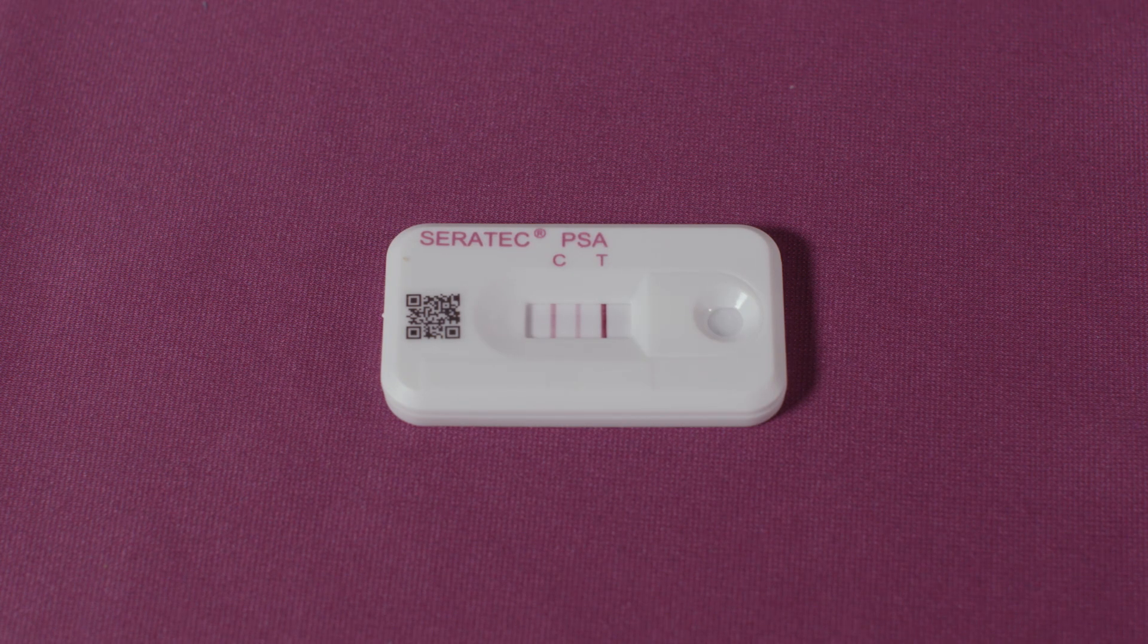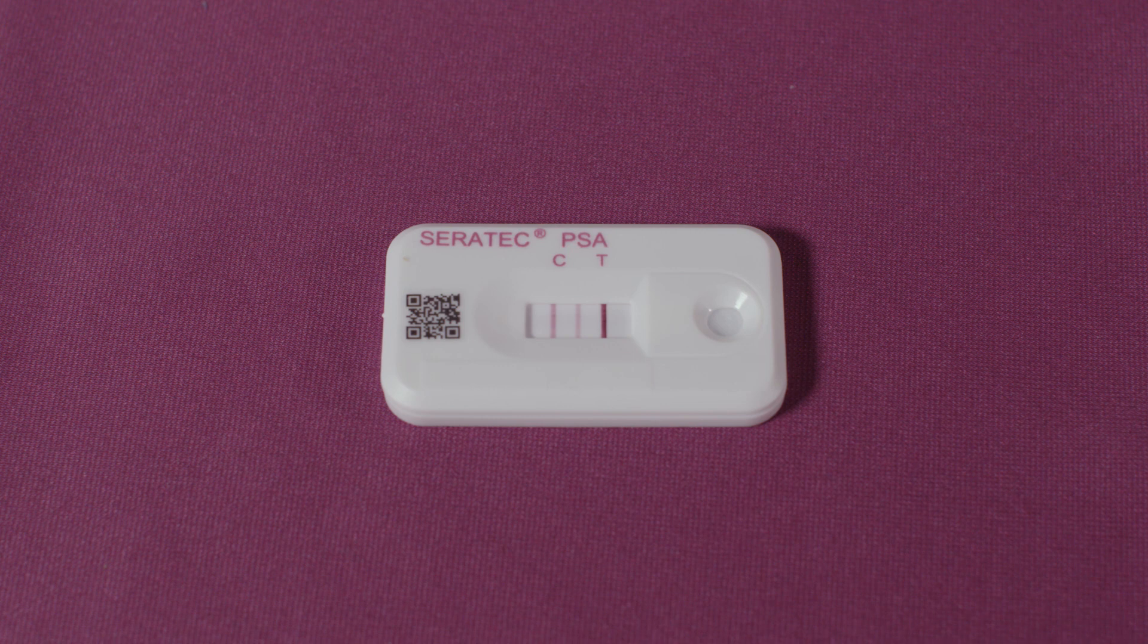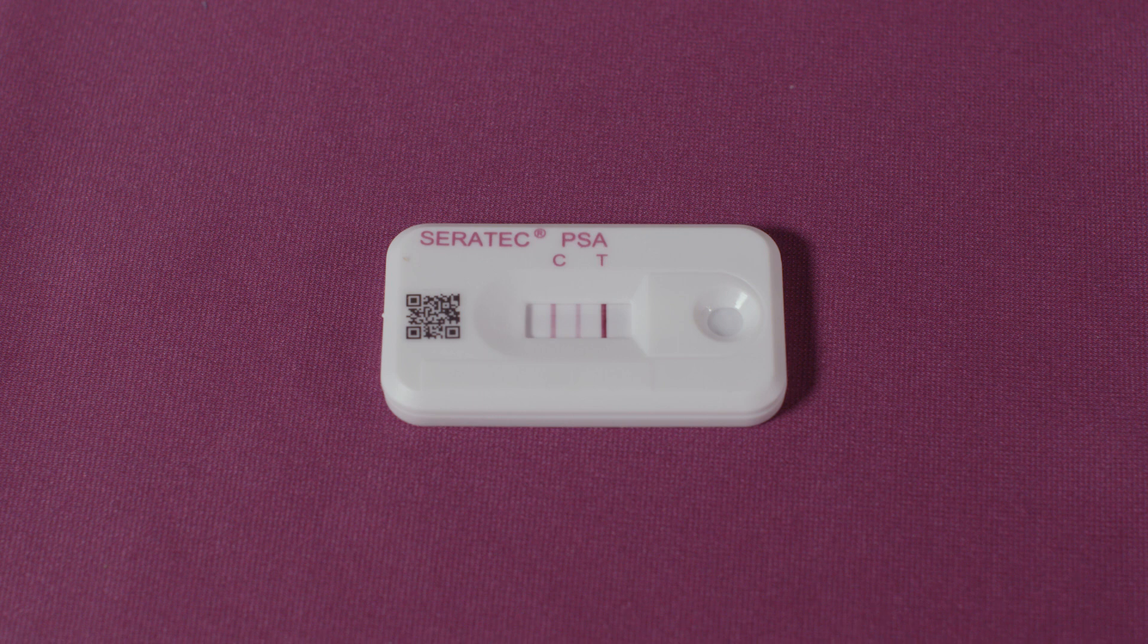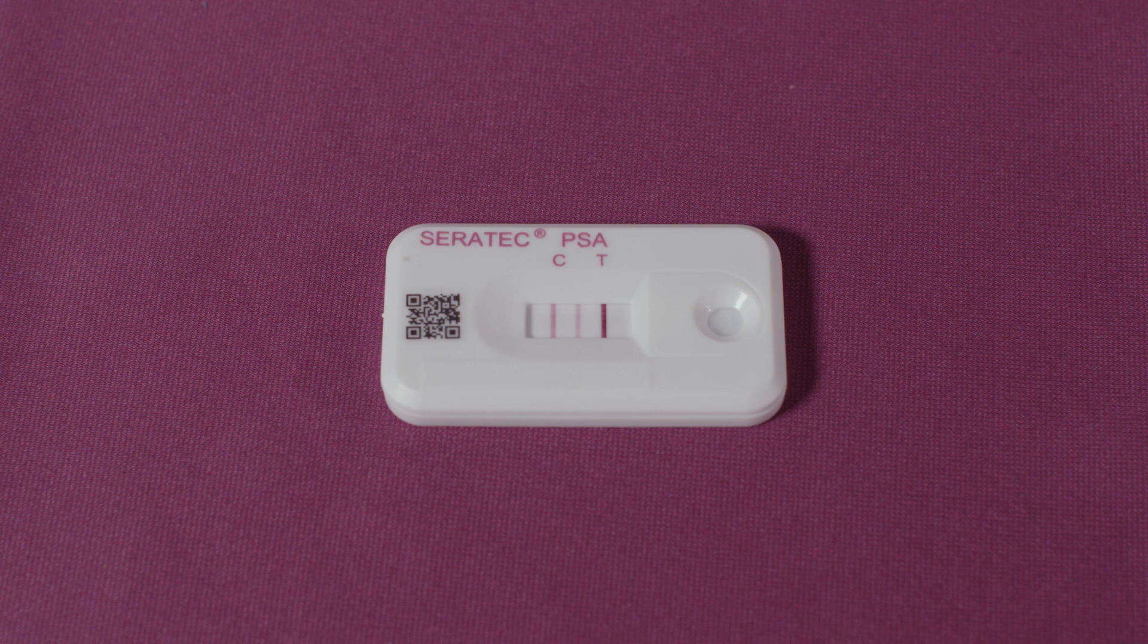The Ceratec PSA semi-quant test is an immunochromatographic assay for the rapid detection of human prostate specific antigen, or PSA, in extracts from evidentiary stains. PSA is a protein found in high amounts in human seminal fluid and is a recognized marker for human semen stains.